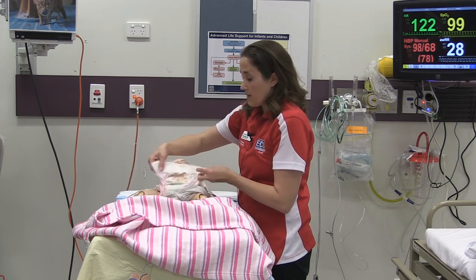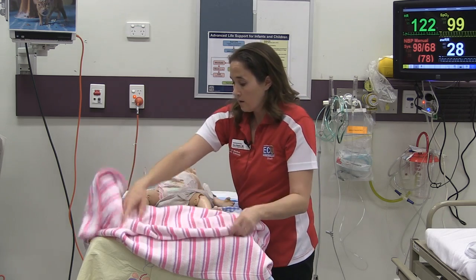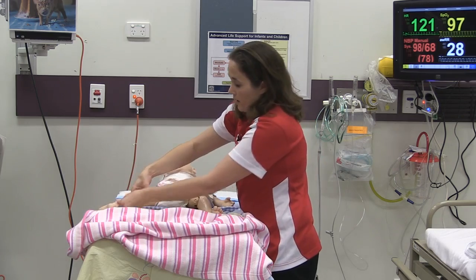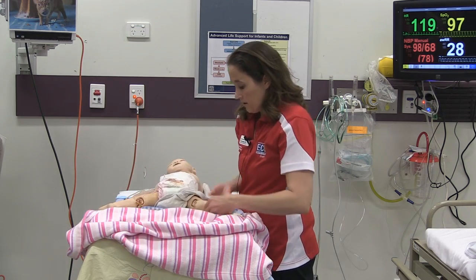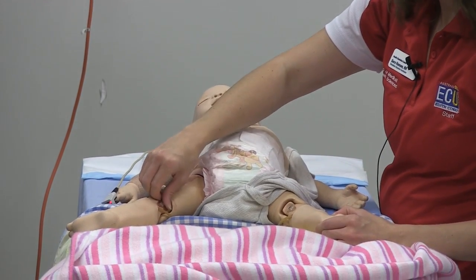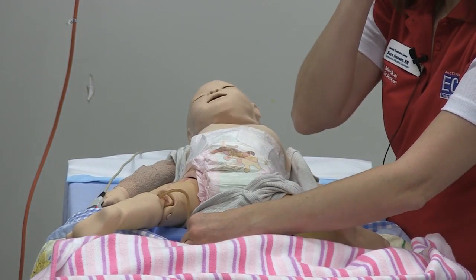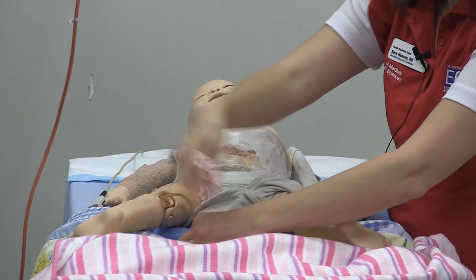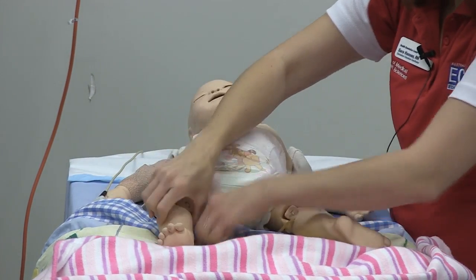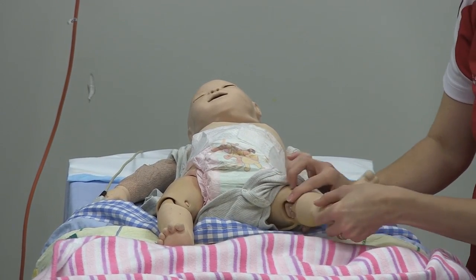This Manikin also has the capabilities of putting an IO in either leg. So if you turn the Manikin over, you can see that we've put blood in the legs before. That allows for a flashback. It's also hooked up via tubing to dump buckets. So you can give fluids in the leg and it goes right into a dump bucket as well, for that realistic appearance. Any questions so far?